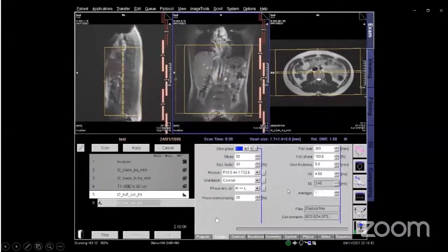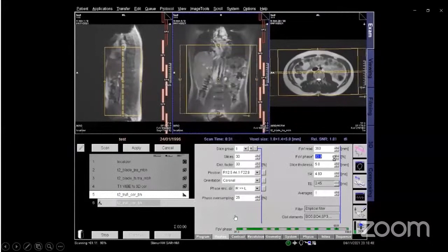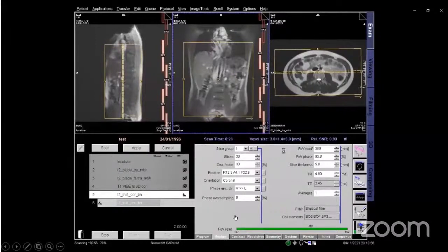Now it is 39 seconds, which is a little difficult for the patient to hold. So you can reduce the time. 39 seconds in a single breath is difficult for the patient to hold, so reduce the time by adjusting the parameters. That will make it easier for the patient to hold the breath. If you can make the time some 20 seconds or 18 seconds, it will be easy for the patient to hold the breath.